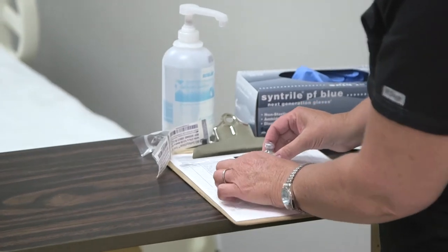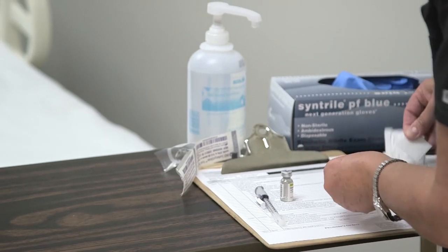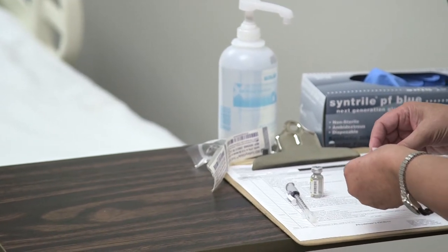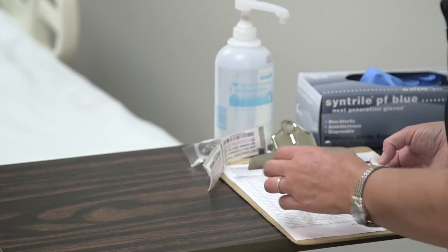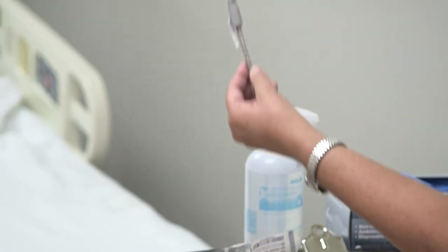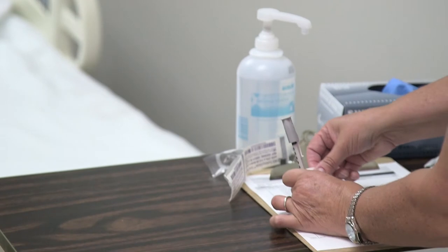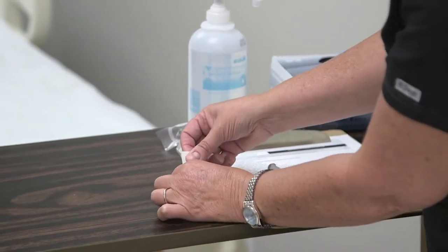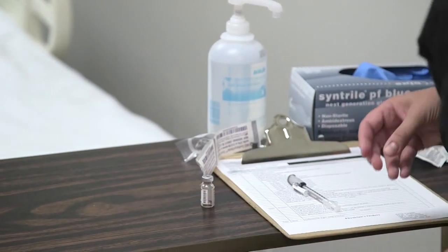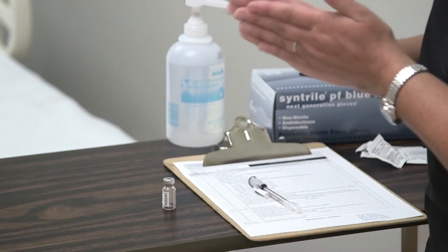Now I'm going to draw this up. Before we do our medication checks, we want to verify we have the correct PPD and the right amount. The typical dose for a PPD is 0.1 milliliters. I'll put this down so you can see it better, then scrub the top of the vial. Make sure you wash your hands first.